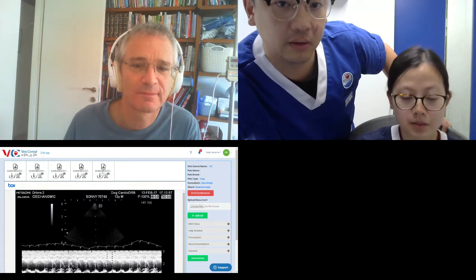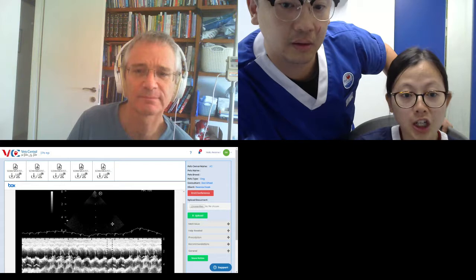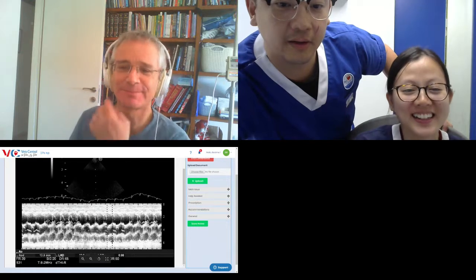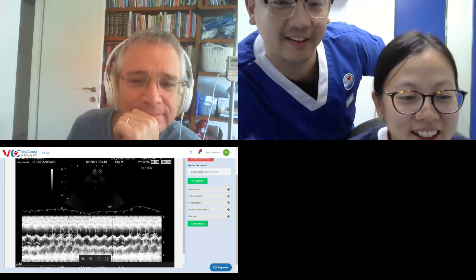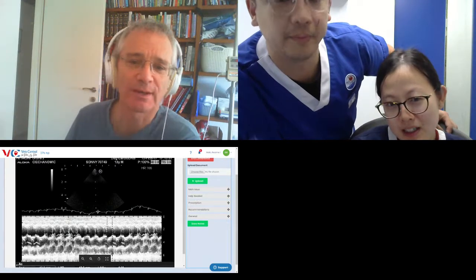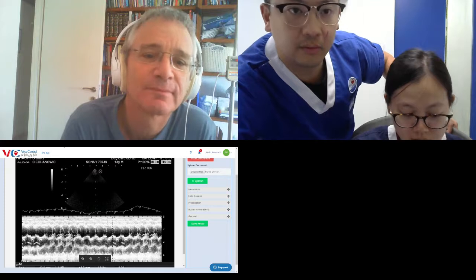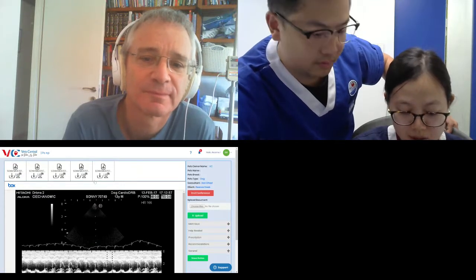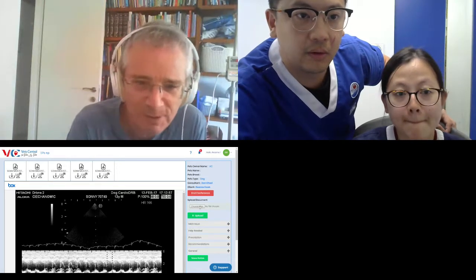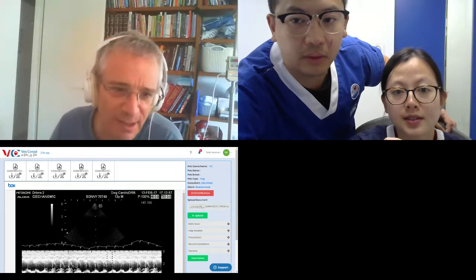Yes, I do see it now. That would be the aorta and left atrium, correct? I guess so. Yeah, I think I see the AO there, so it should be aorta. Are we looking at the same screen? We are. I think we need this shot, which is the representative. So this M mode agrees with what you just said. There is no evidence of left atrial enlargement, and there was no evidence on the short axis view either.